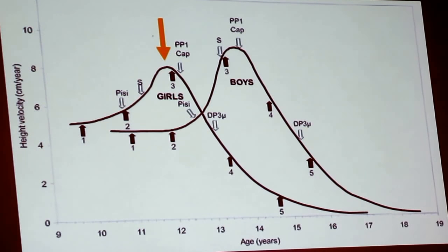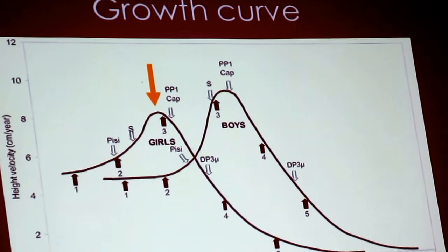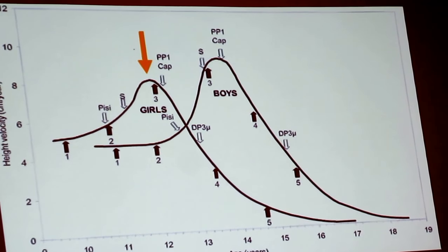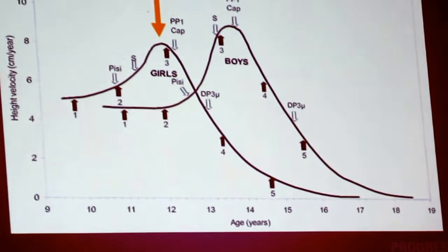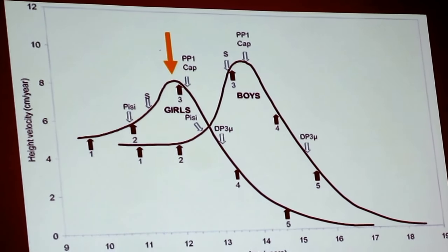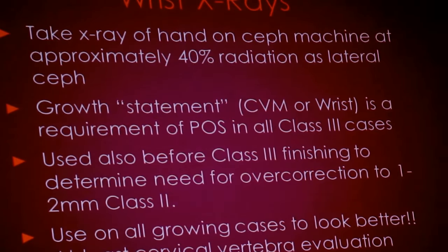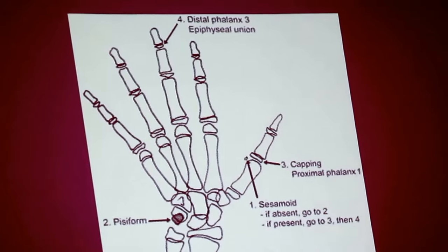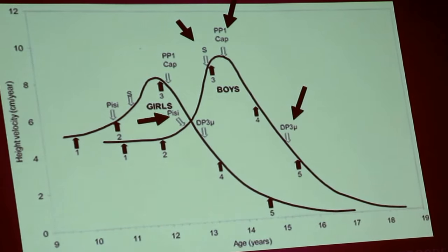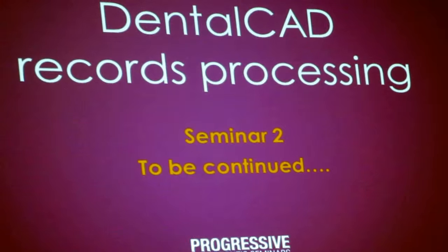Has everybody heard of, let's say, a Herbst, 11, 12 years old, right? Yeah. Okay, so if you're trying to correct class 2, it's hard to catch a boy with, to what we say. They don't follow. You with me? Start talking about the appliances, and then of course we have the good old fashioned headgear machine. Okay. Now let me go back.